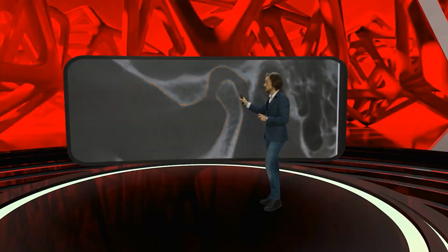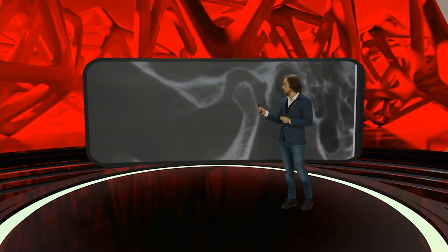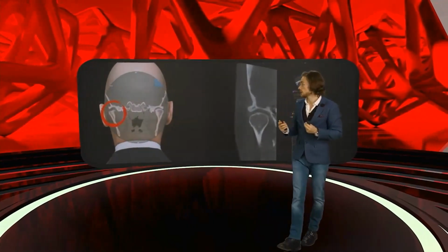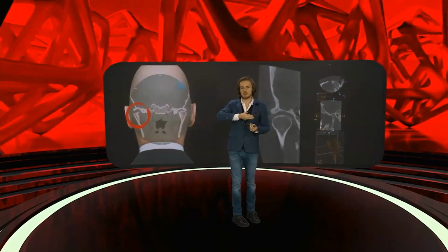The contours that we see in here is a cortical bone, and you can clearly see it because it's white, and it is not interrupted. There are no erosions in here. There are no osteophytes in here. There are no cysts in here. So this is the sagittal view. Now we got a coronal one. Coronal one means that you look from the front or from the back, but you slice the head this way.